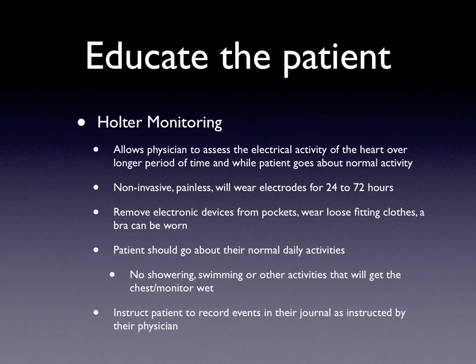Instruct the patient to record events in their journal as they've been instructed by their physician. I know that the video that we watched in class the other day talked about every time you go up the stairs, you need to record that. That's a little specific. Just make sure that they understand that the instructions from their physician are the ones that they should follow.